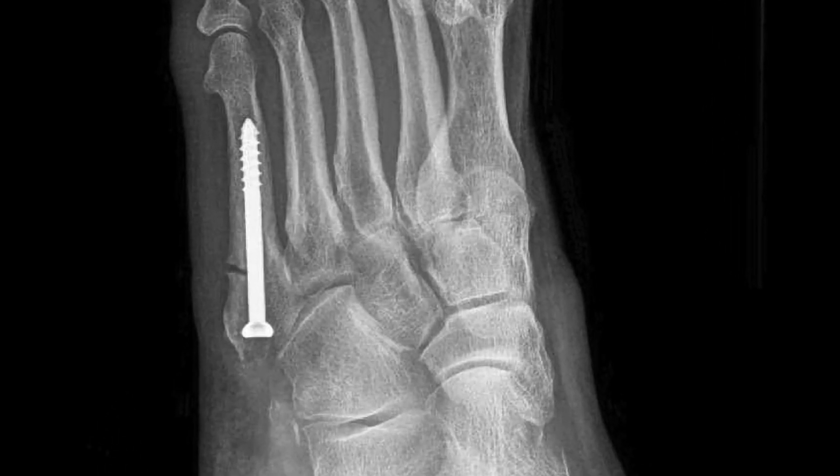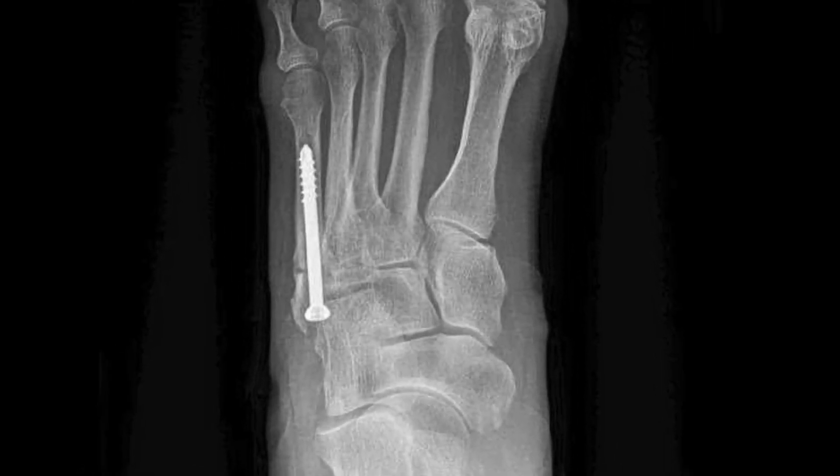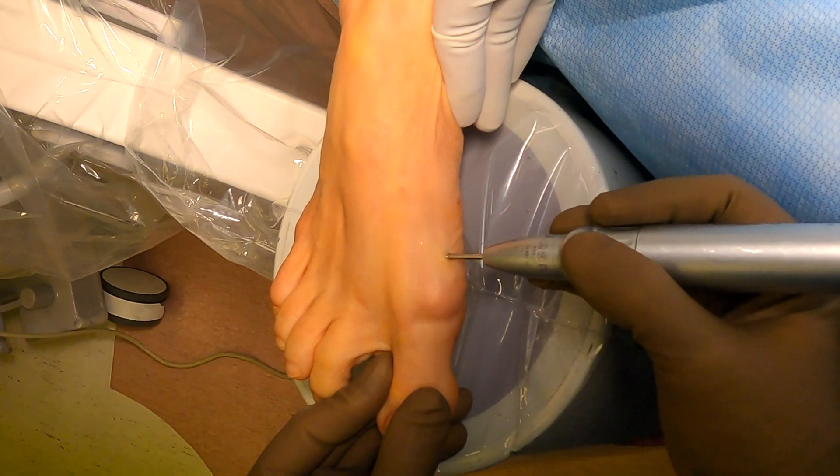After surgery we have adequate reduction of the fracture. You'll still see a little bit of the fracture line on the oblique and the AP view, but this is normal. Just remember that screw is holding it stable in place.